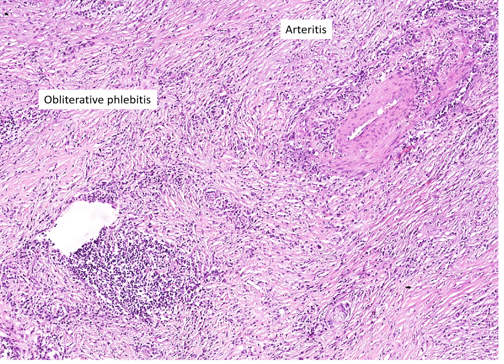Perhaps the most characteristic feature of type 1 autoimmune pancreatitis is obliterative phlebitis, and here's a focus of an obliterated vein. One of the challenges to identifying foci of obliterative phlebitis is identifying these partially or completely obliterated veins. A rule of thumb that has worked very well for me is that most arteries and veins run together. Therefore, if you see a circumscribed aggregate of inflammatory cells like seen here, that's very suspicious for an obliterated vein. An elastic stain can be very helpful.